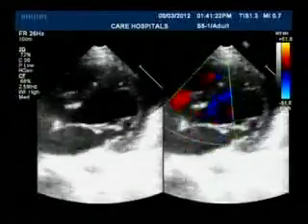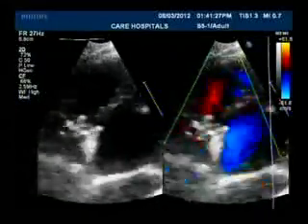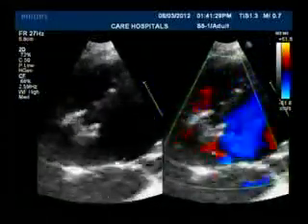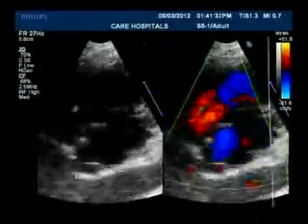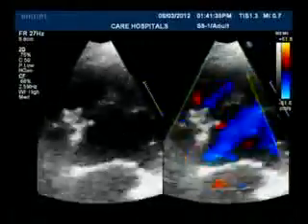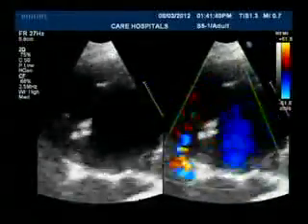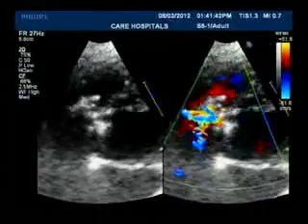Nagesh, can you zoom on to that echo image? Yeah, echo, please zoom it. Yes, now you can see that better. Increase the brightness. You can see that the LV disc is very well conformed to the septum, and the central portion of it is sitting across the VSD. So I'm going to do an angiogram here again.